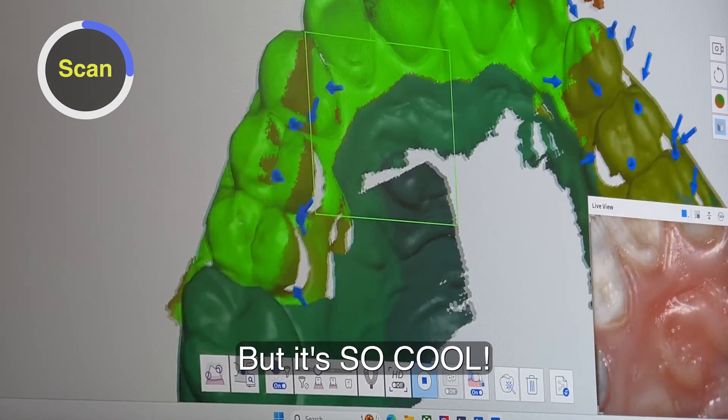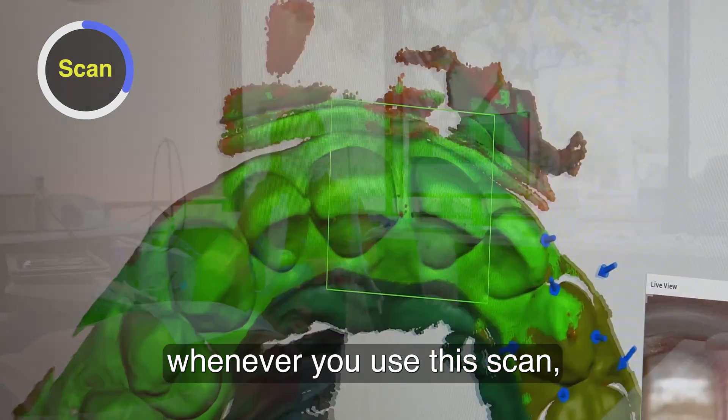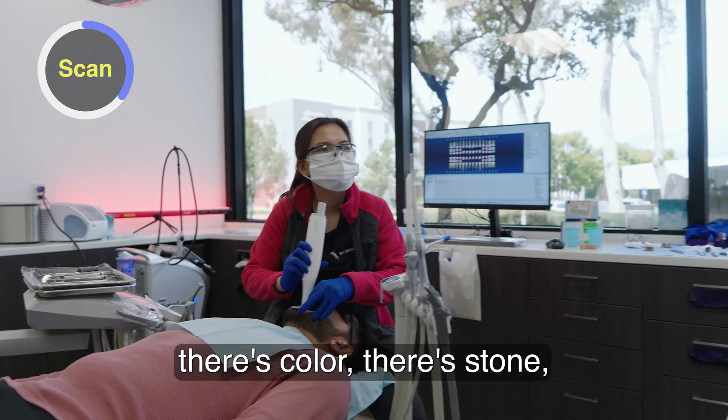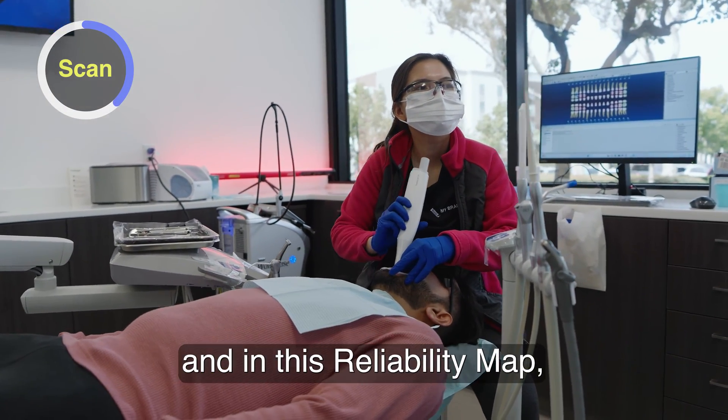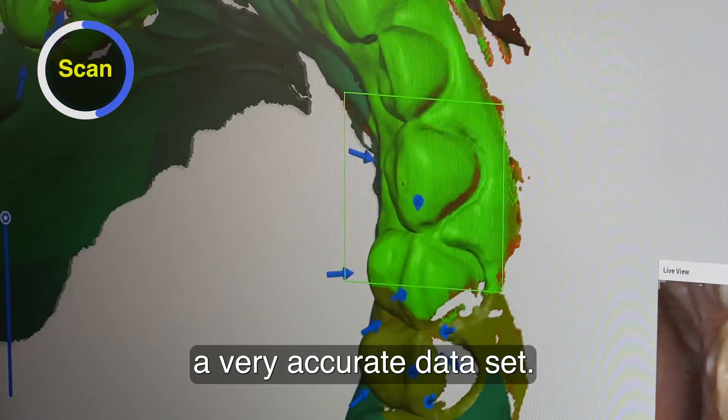I didn't really know what it was, but it's so cool. Now what I understand is whenever you use this scan, there's color, there's stone, and this reliability map — this bright green is indicating a very accurate data set.